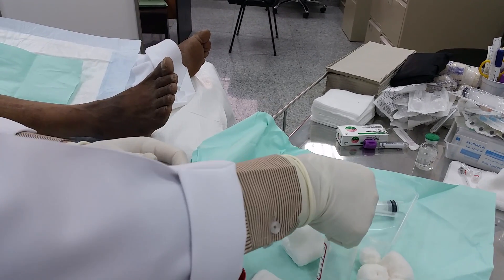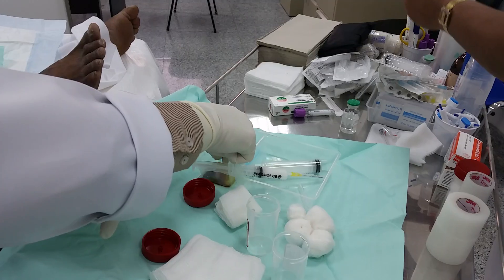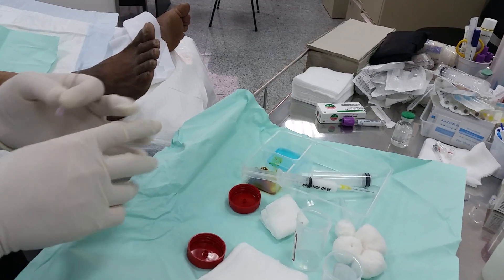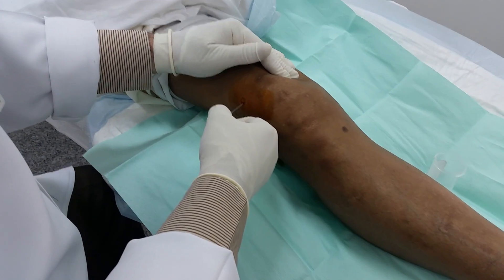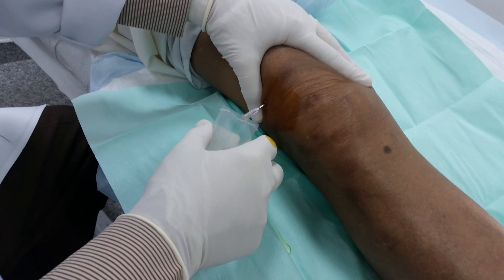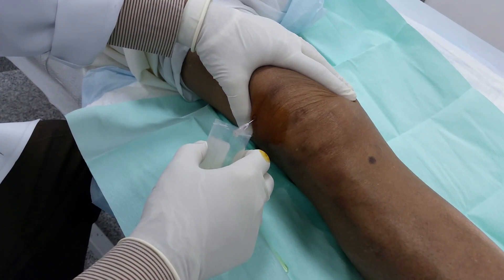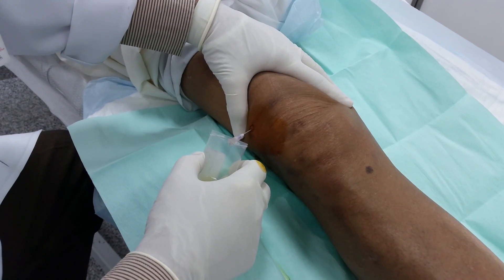Be careful not to contaminate it. Give me another 18-gauge needle. We will use this for collection. In the name of Allah — I will insert it. As we see, we have a gush of fluid. Relaxing. You can see the fluid is coming easily. The reason I don't use a syringe is that syringes have a long lever and sometimes cause sudden movement and sudden injury.